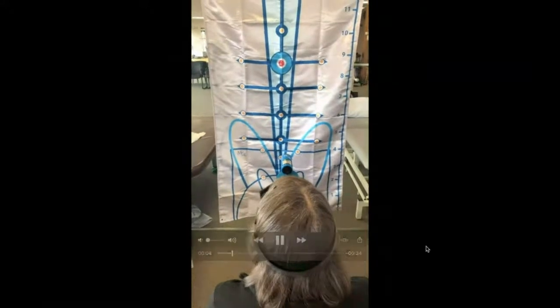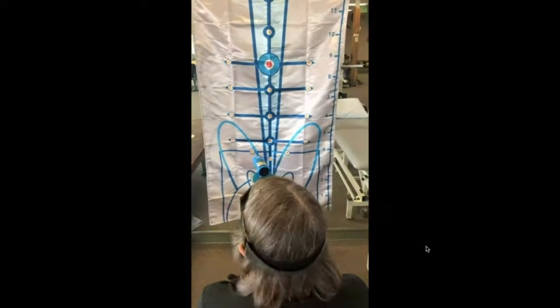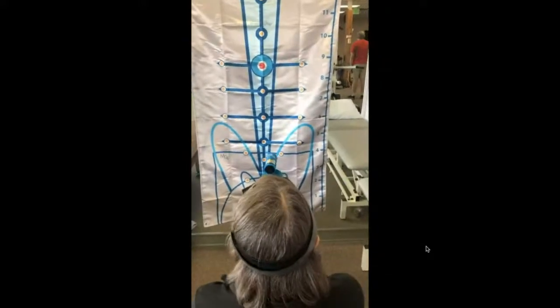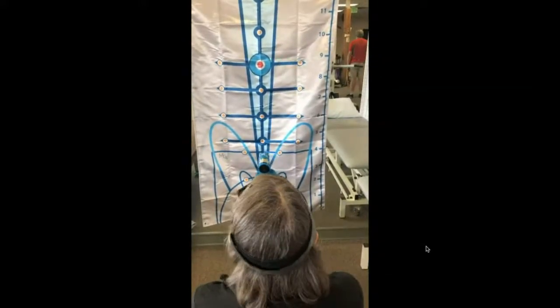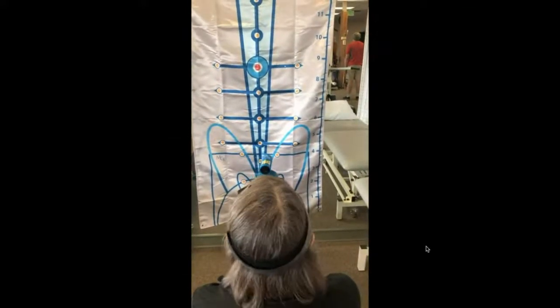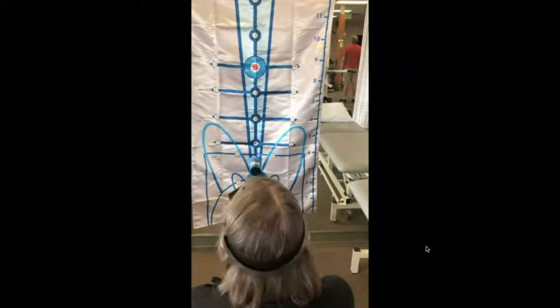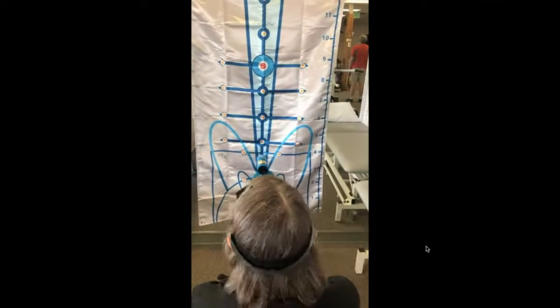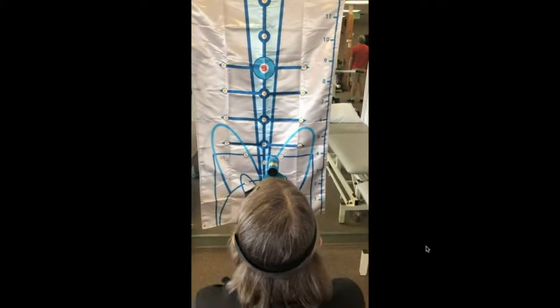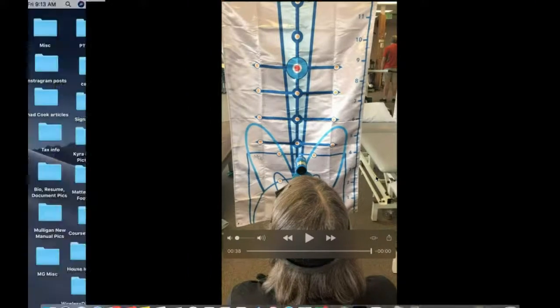So let's give one more attempt with her. Hey, go ahead and keep your eyes on those orange guys, and let's really make sure you're getting full motion side to side as you're going through. Okay, and then the increases here would just be for hertz, what her tick-tock motion back and forth, what the speed would be there. And so she's definitely slowed down, but she's understanding where her parameters are for having normal responses to her VOR. Okay, and this is still very difficult for her on day one, but she's getting some good understanding.